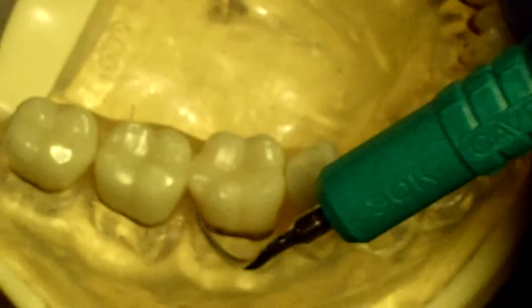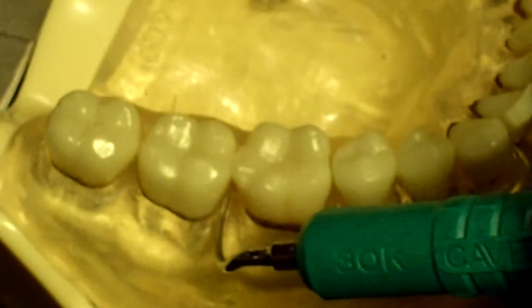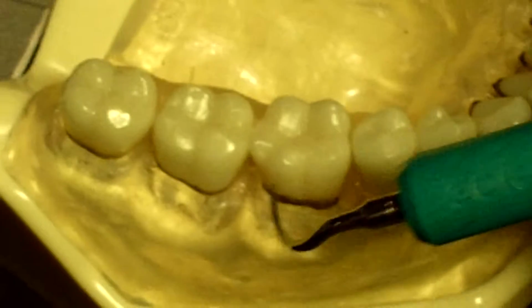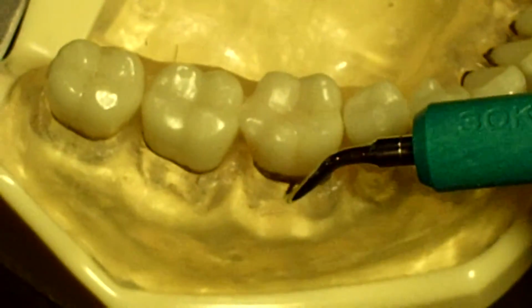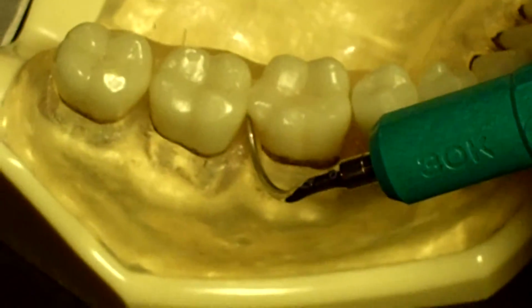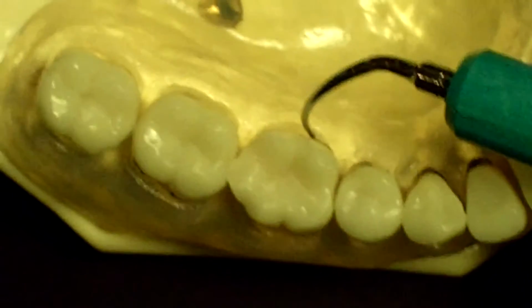So the left insert here is being used in the transverse or toe-up approach for supra deposit. We don't want to use this into the furcation, because as you can see, we would be toe on. So if we use the insert here on the transverse, we know that it's the correct insert on the opposite side in the vertical periodontal approach.